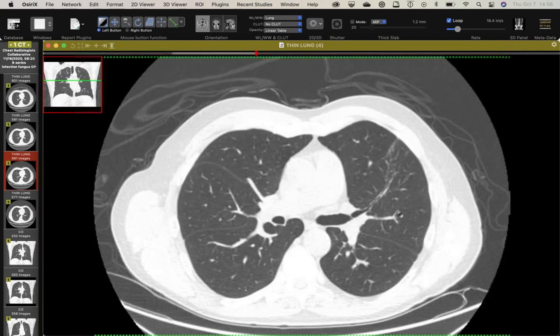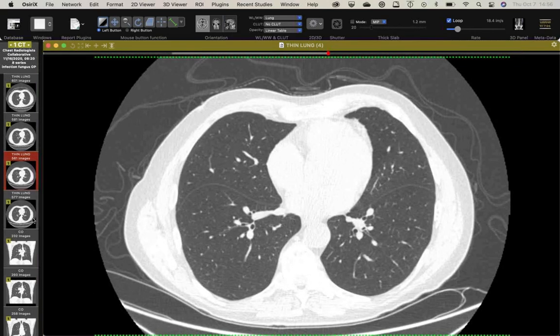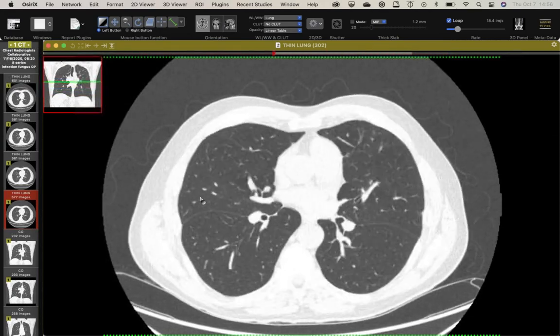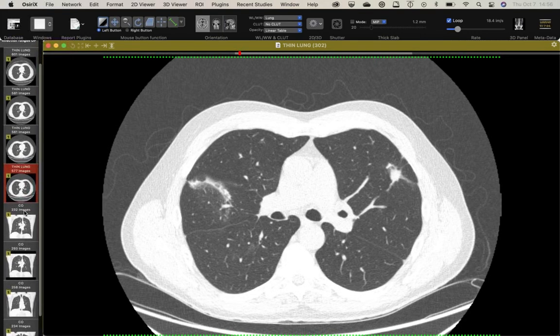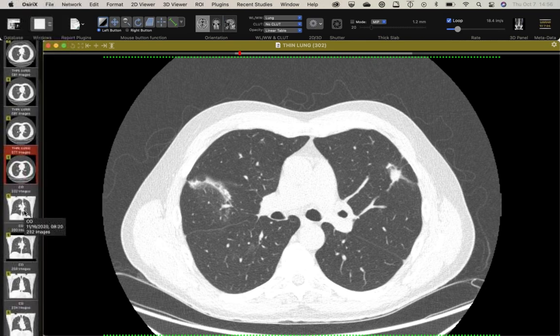It's a little smaller, but it looks different than the rest of it. And I've got serial imaging showing the OP evolving. Here we are with the nice sort of atoll down there. But again, this mass just getting a little bit smaller. So finally, someone puts a needle in this thing as it's getting smaller and gets cocci out of this.